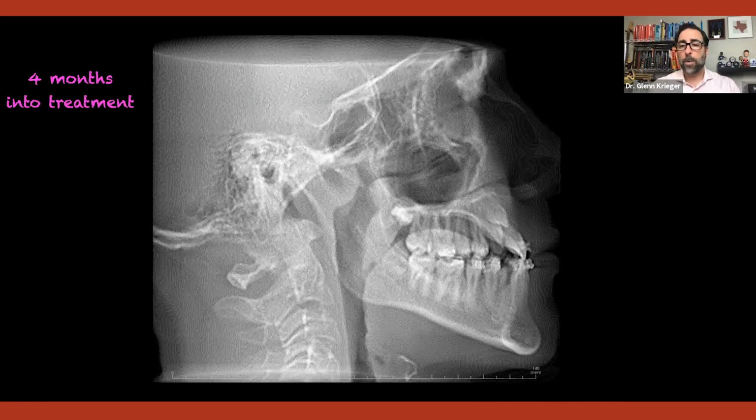And then, at this point, for a whole series of reasons, we did not take out the primary cuspid to begin. I'll get into that discussion another time. But I wanted to leave that left side primary cuspid to act as sort of an anchor to keep the lateral from going more distal. I didn't want it to go distal. So again, this is the CBCT I've got.